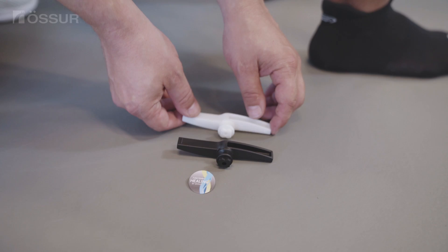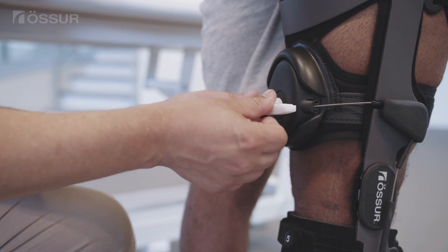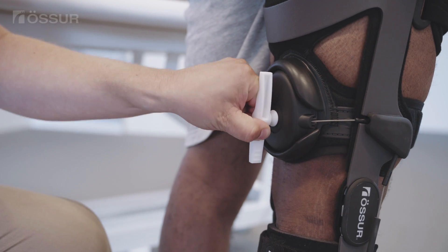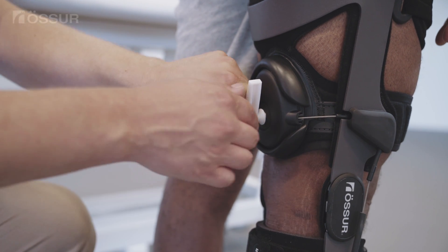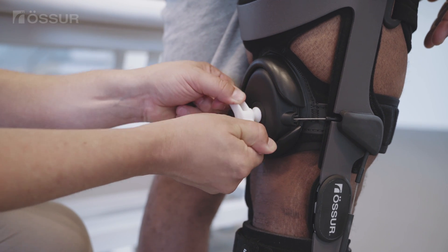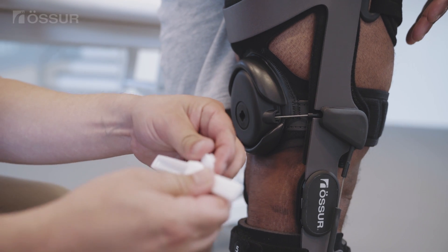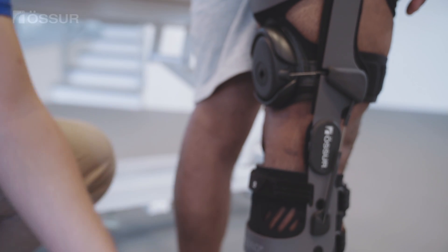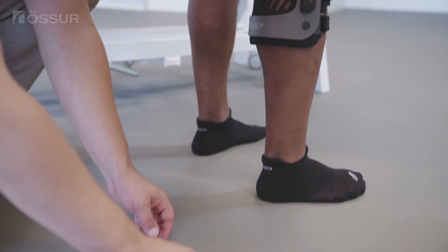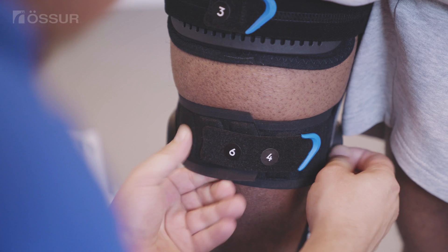White is standard load; black is low load. Place the desired shear knob in the hole on the spool. With the patient's leg in full extension, slowly turn the shear knob in a clockwise direction until the shear knob breaks. Discard the two pieces of the shear knob. Place the DTS sticker on the spool to cover the hole.